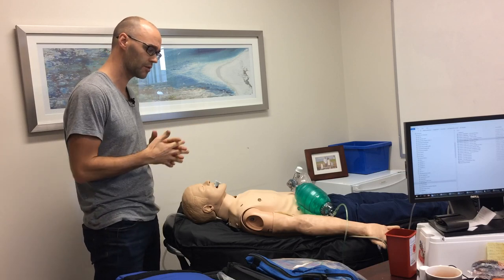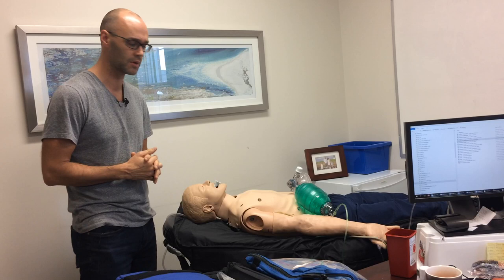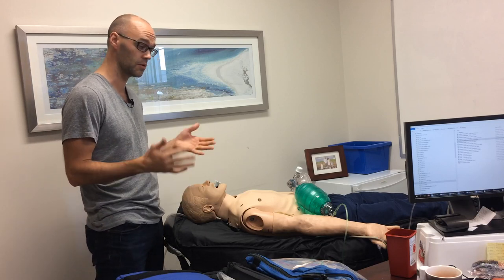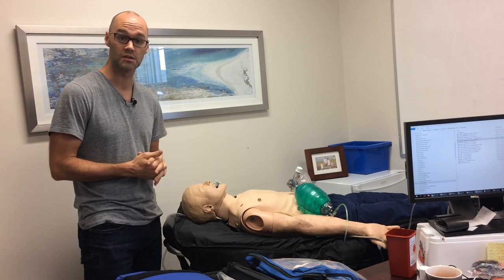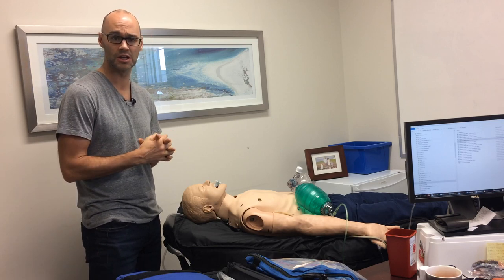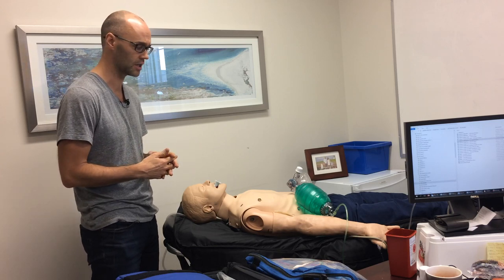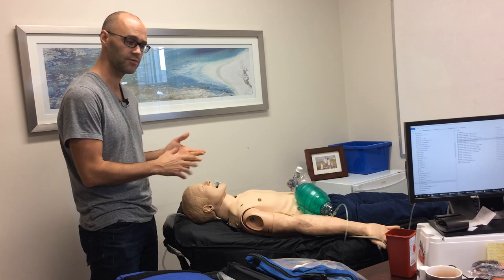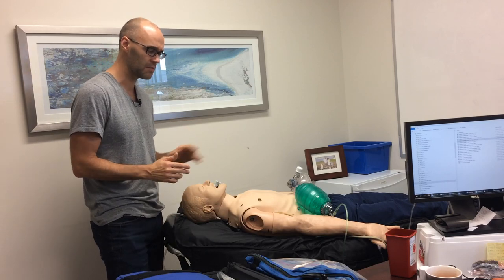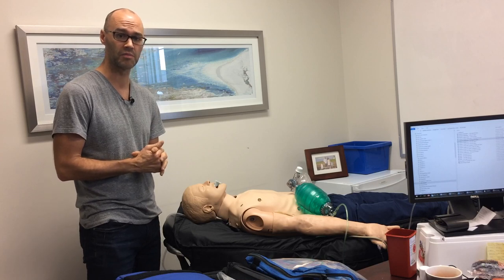We need to look first at whether we have adequate minute volume. If they don't have adequate minute volume, then we need to provide positive pressure ventilation. And if they don't have adequate oxygenation, we need to be thoughtful about how we can best pre-oxygenate: high-flow oxygen, sit them up 20 degrees, and maybe add some PEEP to your bag valve mask.